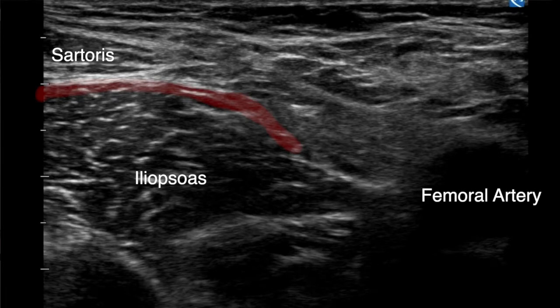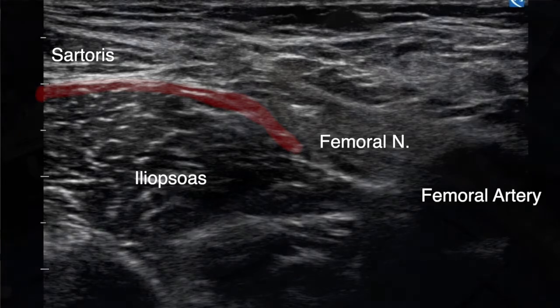The target area is the fascia iliaca space lateral to the femoral nerve. Also included in this space is the lateral femoral cutaneous nerve, which runs obliquely and more superior on the iliacus muscle.